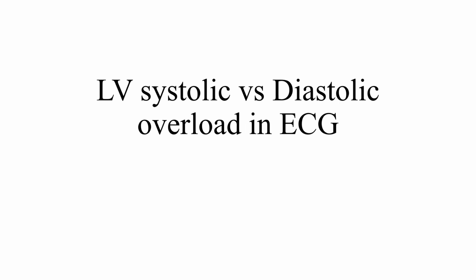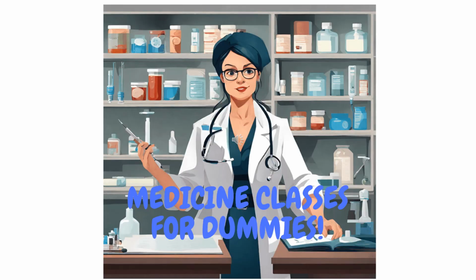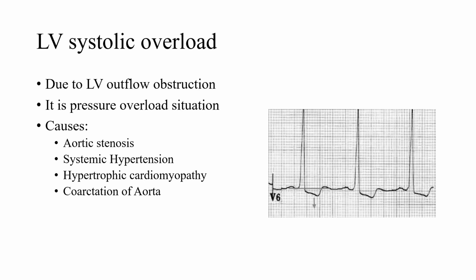In today's class, we will discuss how we differentiate LV systolic overload from a diastolic overload in ECG. That is LV systolic versus LV diastolic overload in ECG. Systolic overload will affect the systole part of the ECG, while diastolic overload will affect the diastole part of the ECG.